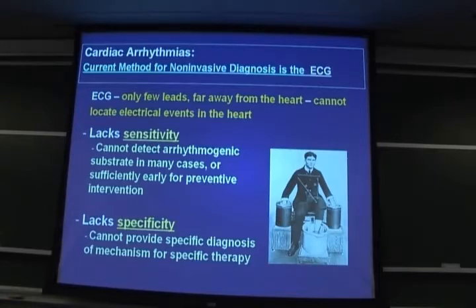And in these days of understanding of mechanisms that is so refined, we know mechanisms of the long QT syndrome, one kind of arrhythmia, based on ion channel function and hereditary mutations. And so we know a lot about mechanism at the molecular and cellular level, but the ECG cannot really detect what is going on in the heart with that kind of specificity. And the most important property of the ECG is not just that it's far away. The most important, and what works against us, is that when you measure the potential generated by the heart at any point on the body surface, anywhere, it does not measure the electrical activity under the electrode.